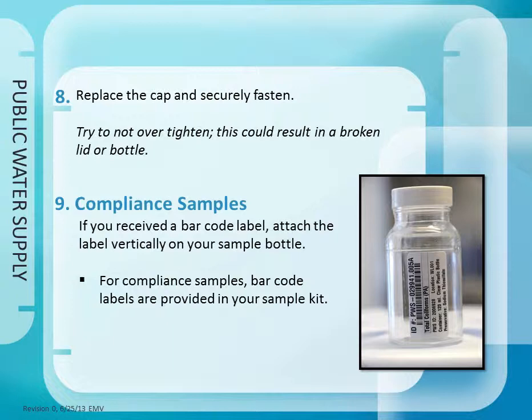Step 8: Replace the cap and securely fasten. Try not to over tighten, as this could break the lid.